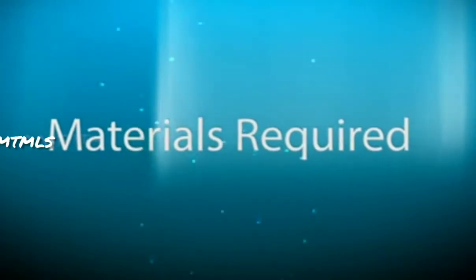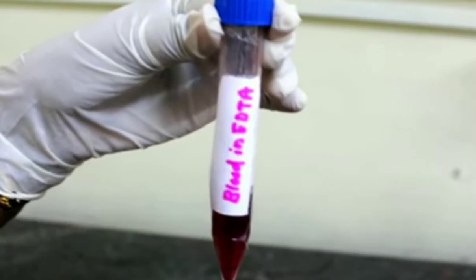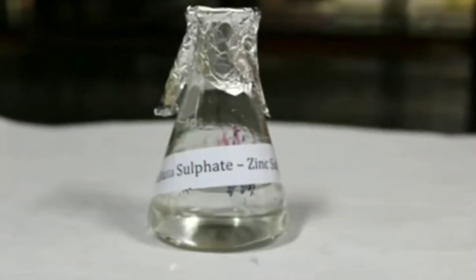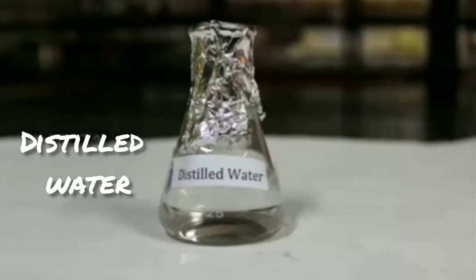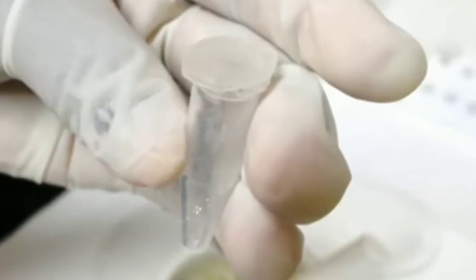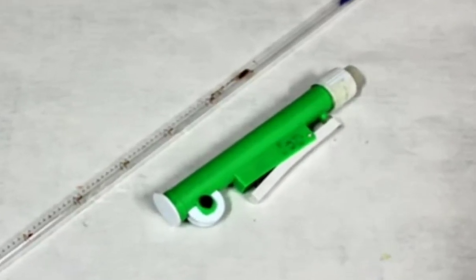Materials required: blood sample collected in an EDTA bottle, glucose oxidase reagent, 2 normal sodium hydroxide, sodium sulfate zinc sulfate reagent, 200 mg per deciliter of standard glucose solution, distilled water, test tubes, micropipettes, Eppendorf tube, 5 ml glass pipette and pipette pump.